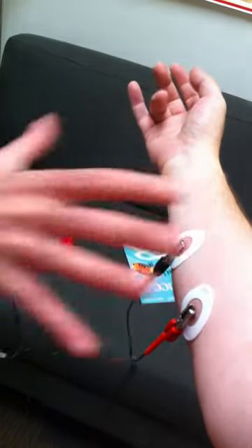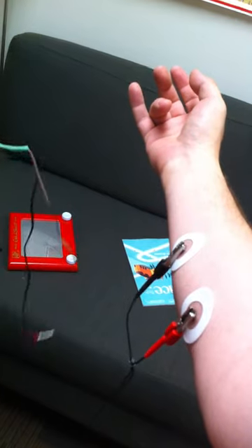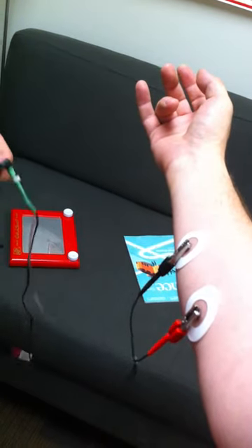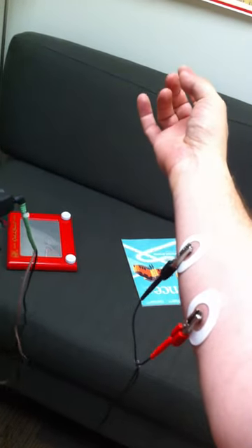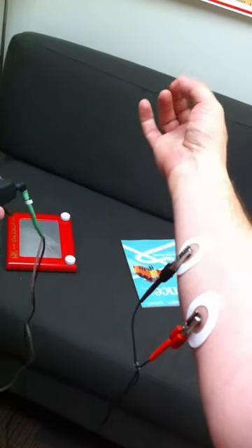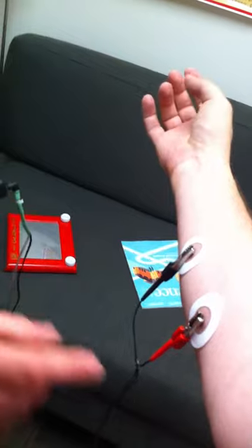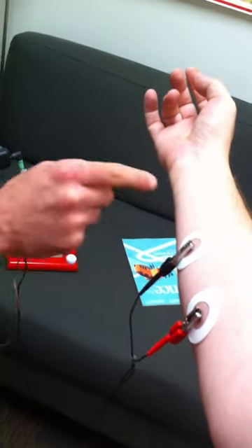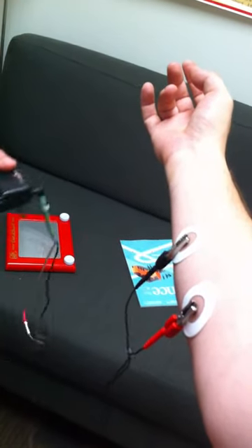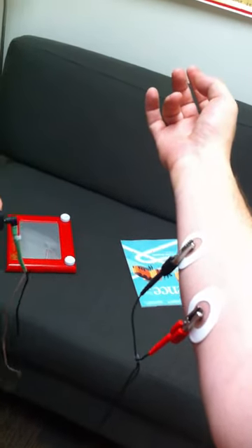These electrodes really help to spread it out. So, did you put it on this one intentionally? Or if you move it around, can you do the other ones too? Well, the ulnar nerve runs really close to the surface, so it's an easy target.